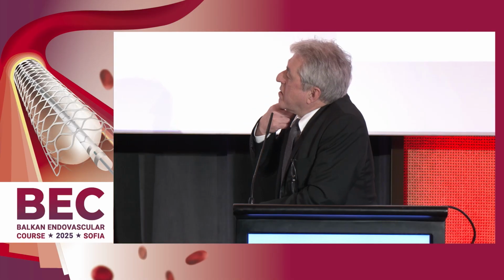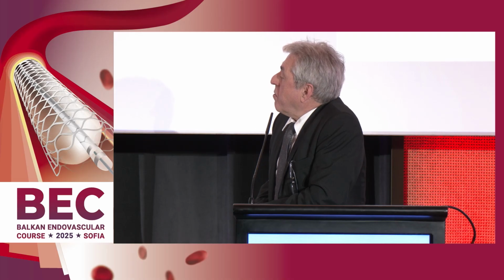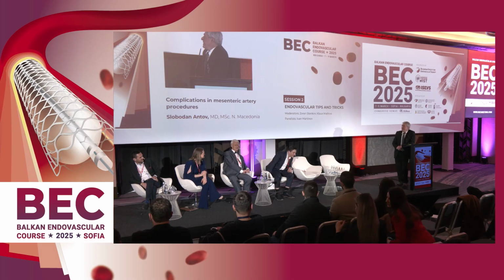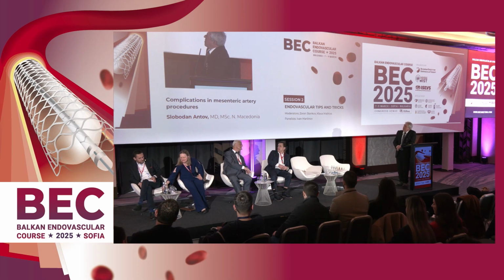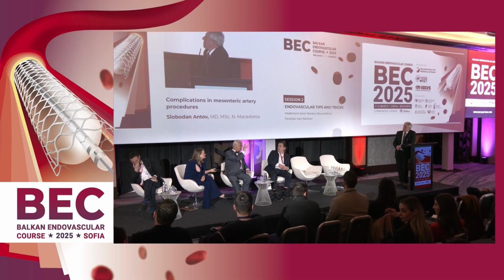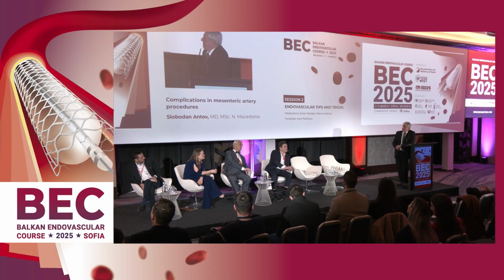No, I'm asking about carotids. Which kind of stent would you use for that question from your colleague, your girlfriend? Yes, my girlfriend. Yes. As I told you, it's the same. Use a stent. My question is, there is a double mesh expandable stent, Roadsaver stent. Roadsaver, for example, because it also has small meshes, we have these hybrid stents today. In former times, we had only the Wallstent, and when I started, I used the Wallstent because the cell size is fairly small, but today we have better devices.